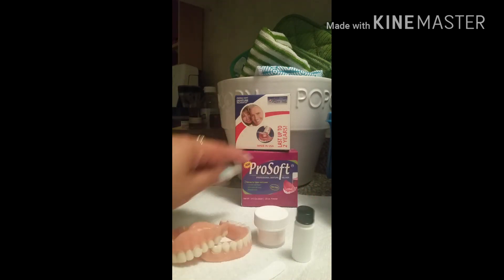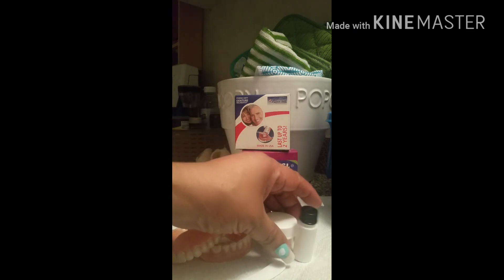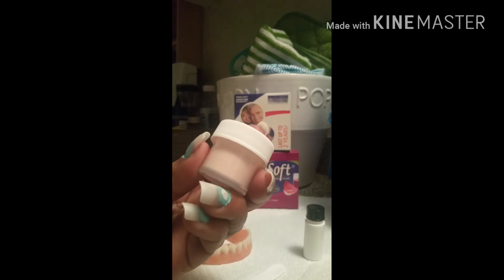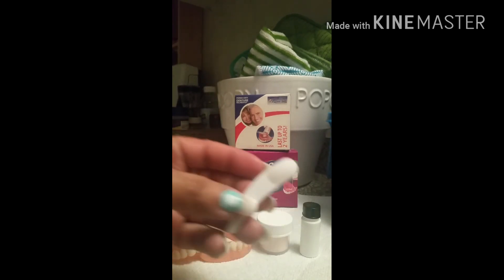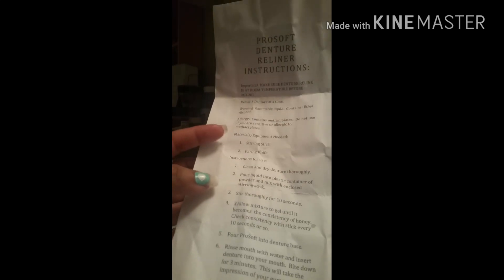In the ProSoft box you get two relines — for upper and lower. You get the powder, the liquid, the containers, the stir stick, and of course the instructions. You're definitely going to want to look those over before you get started.